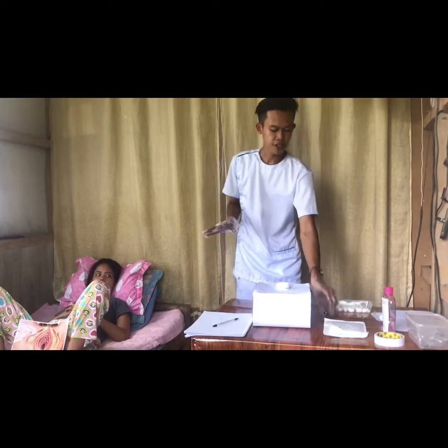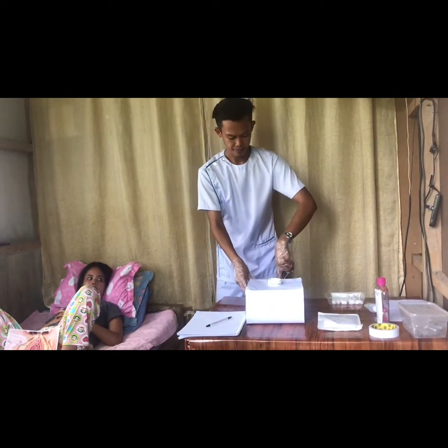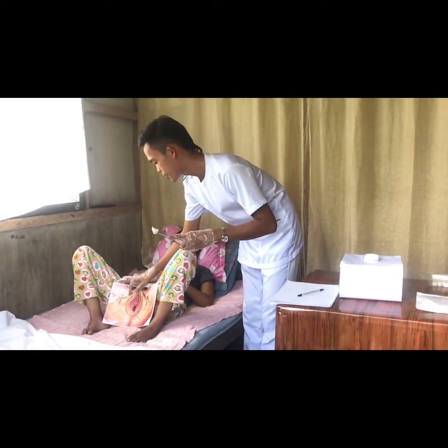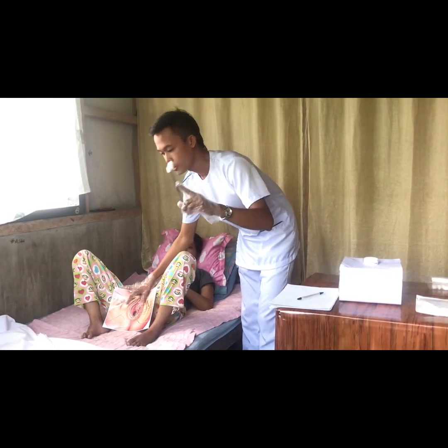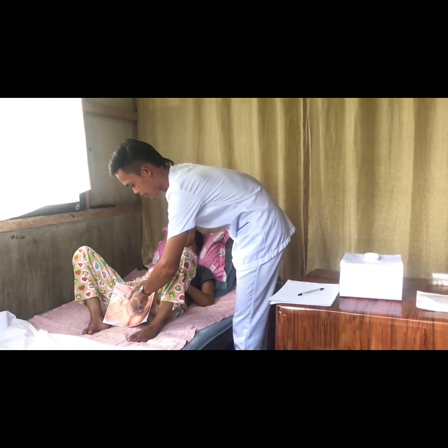So all we have to do for this procedure is to collect all of the items that we're going to use. So I have here my forceps, and the next thing that we're going to do is to pick up cotton balls, and at the same time we're going to soak it with disinfectant solution. Okay. So now, with my non-dominant hand, I'm going to use this to spread the labia of the patient. And the cotton ball that we're going to use is to clean the top and the lower portion of the labia of the patient.